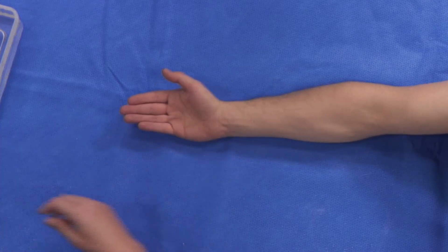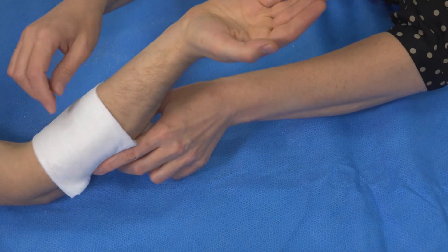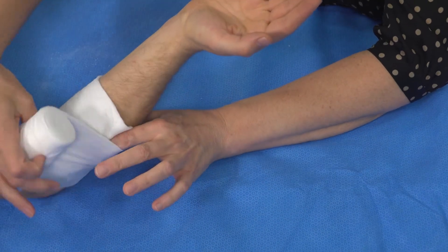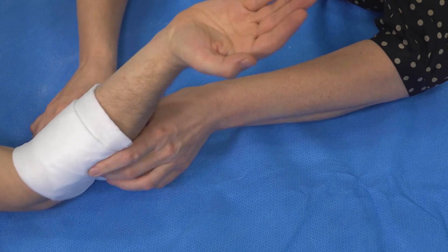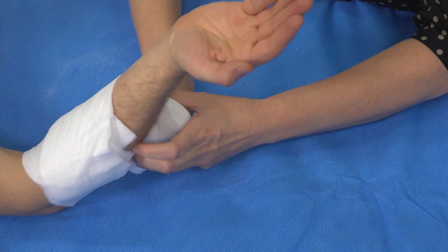As with most Plastercast applications, we start with a comfort layer. This should always go further than your cast is going to go, so that the cast doesn't dig into the skin at the ends.